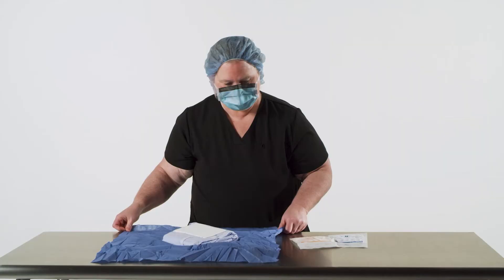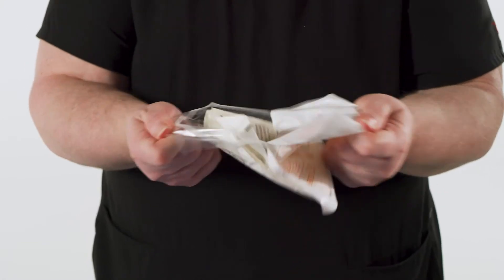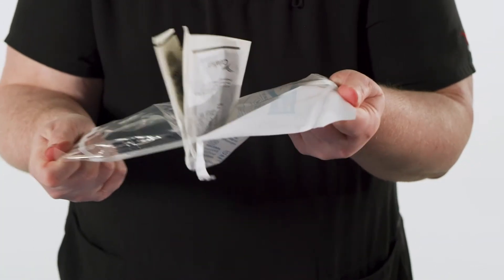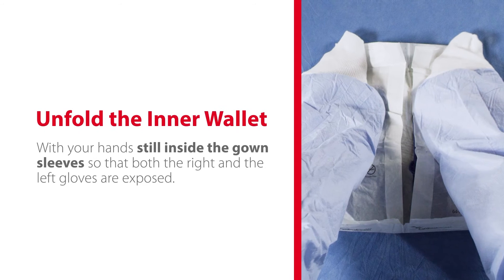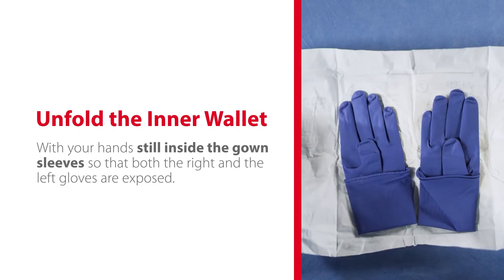Open the outer wrap of the glove package starting at the top edge. This will expose the sterile inner wallet that contains your gloves. Flip the sterile inner wallet onto the sterile wrapper. Don the gown after surgical scrub. Unfold the inner wallet with your hands still inside the gown sleeves so that both the right and left gloves are exposed.